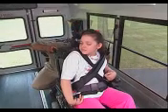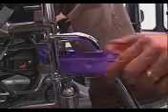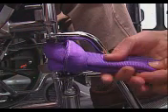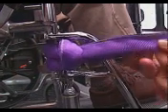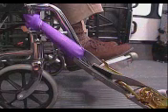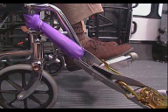There are instances when extra restraint may be needed. In this event, 2 additional rear straps shall be used. There are also times when a structural member is not easily accessible. The quick strap may help in these instances. This strap attaches to the wheelchair and provides highly visible anchoring points for the strap assemblies.